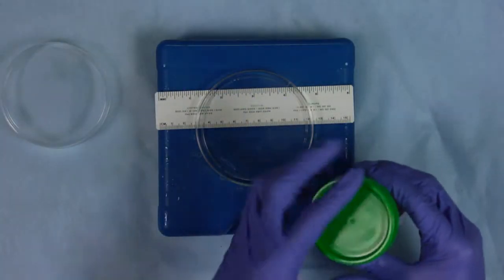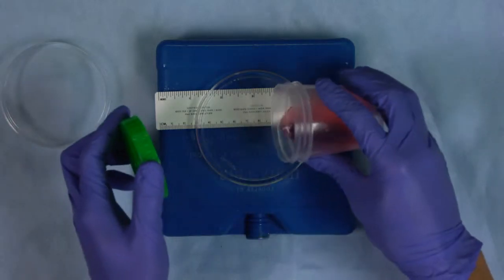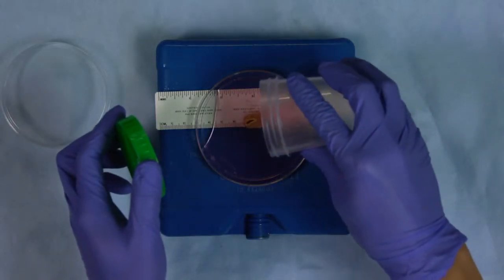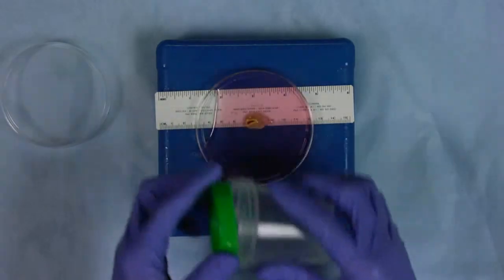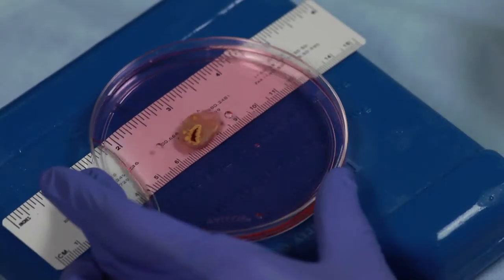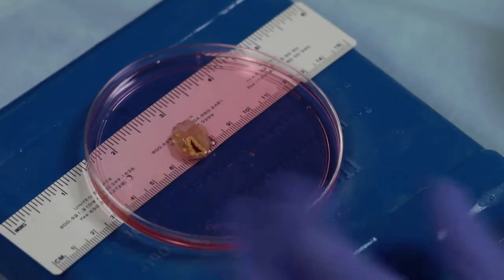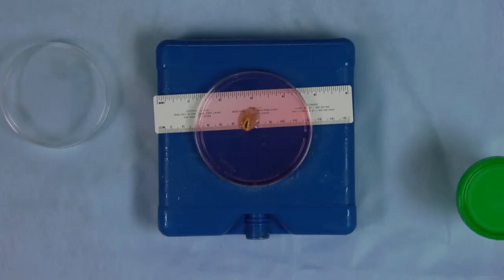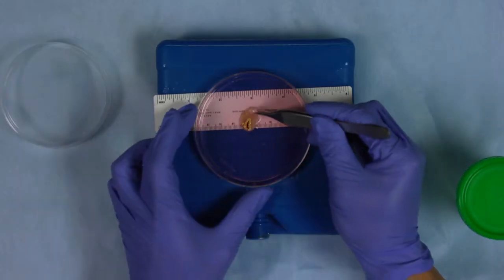The tissue will come from the operating room in the holding media as specified in the protocol. Tip the ovary out into a 100 millimeter petri dish on ice. Depending on your site, a portion of tissue may have already been removed for pathology. If still necessary, remove the specified portion now.